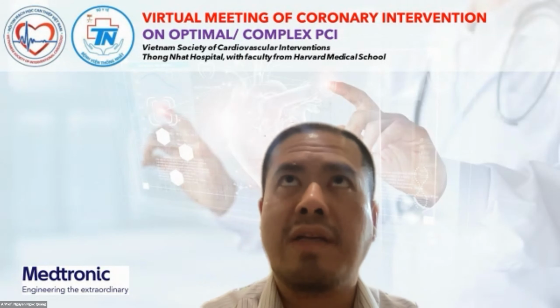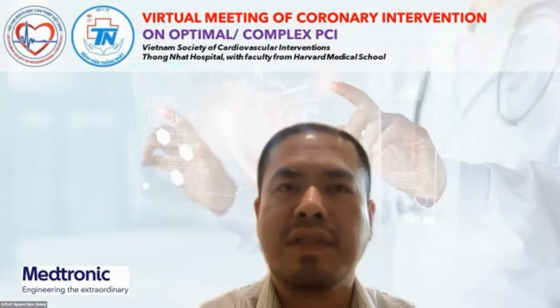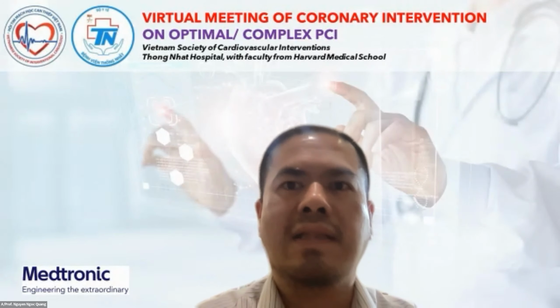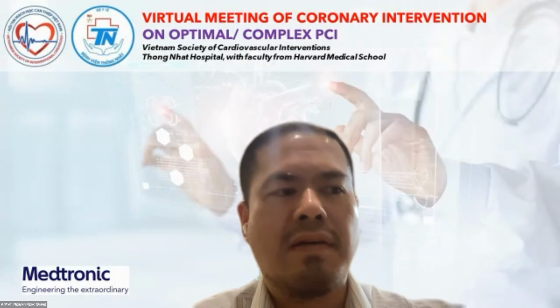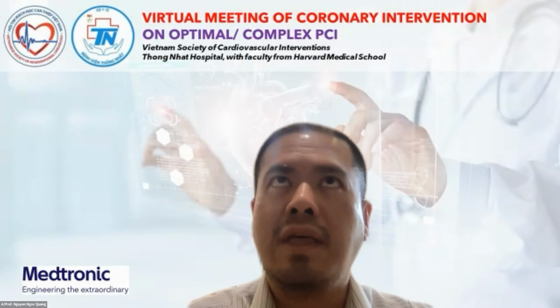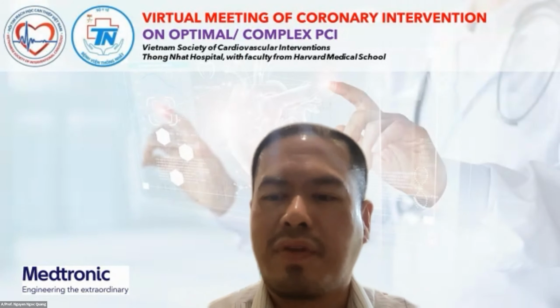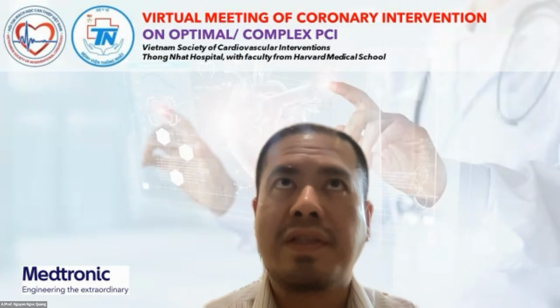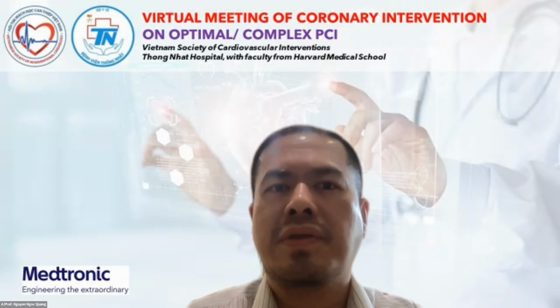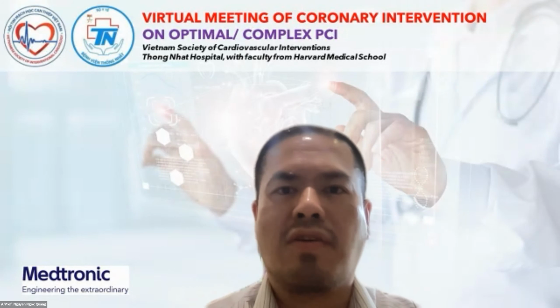And I think the last thing that is very important and more relevant recently is that failing is not a stop for the procedure. Failing sometimes the first time is an opportunity to succeed on the second attempt. The new data from the Chinese colleagues show that when you puncture, if there is no complication like a hematoma for the CTO lesion, even if you fail the second time, you have more chance to succeed. So I think that is something new in the CTO area, and the question of when to stop is very important for us. That is my comment.